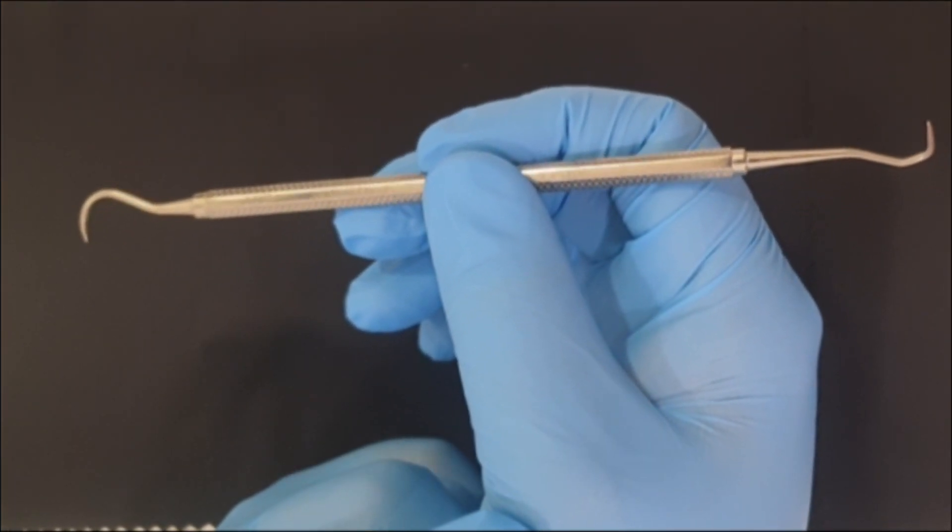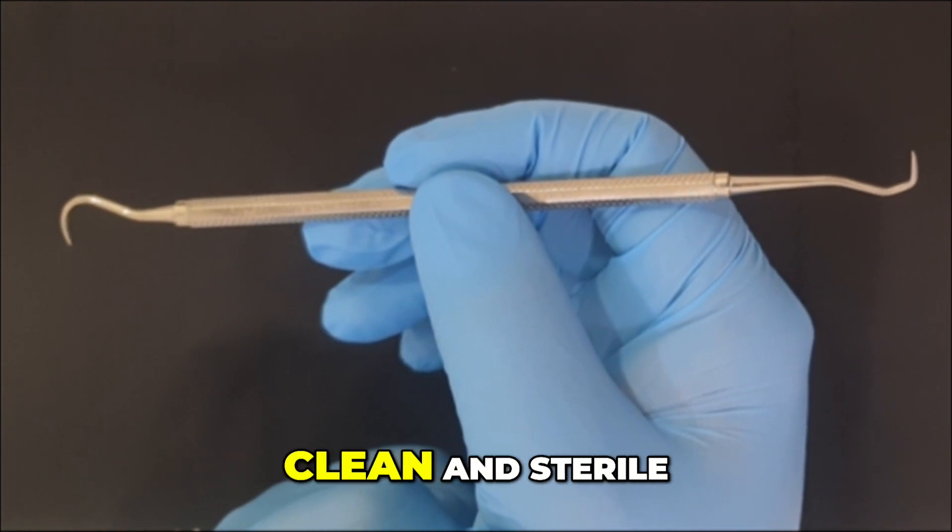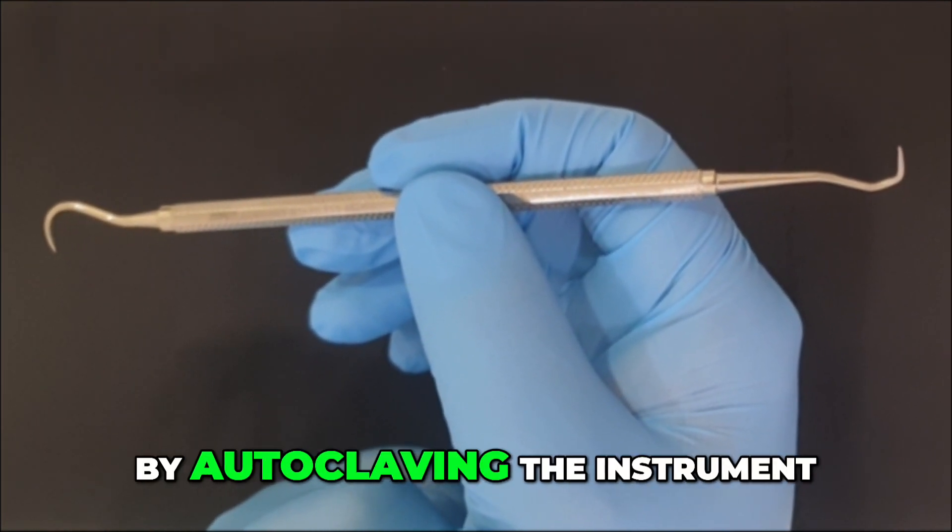The next principle is the condition of the instrument. The instrument should be clean and sterile. You can make sure the instrument is sterile by autoclaving the instrument.